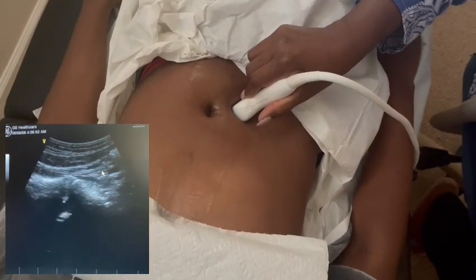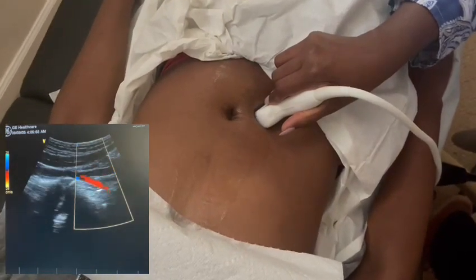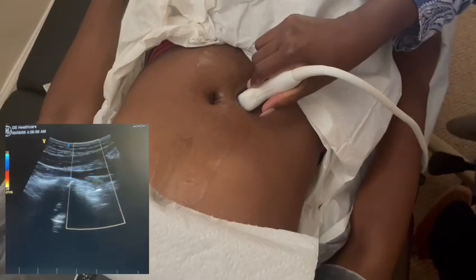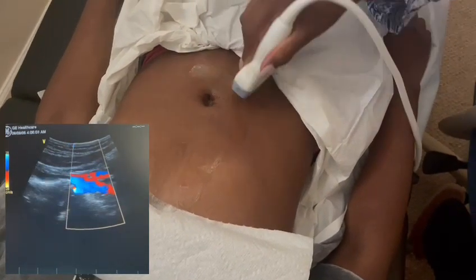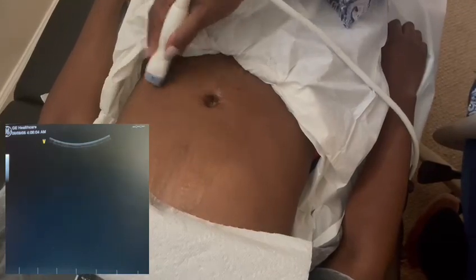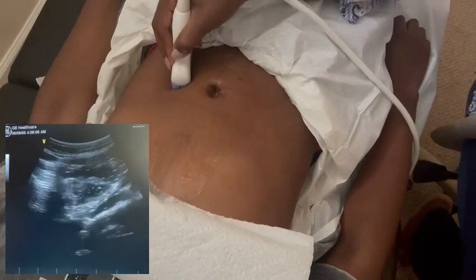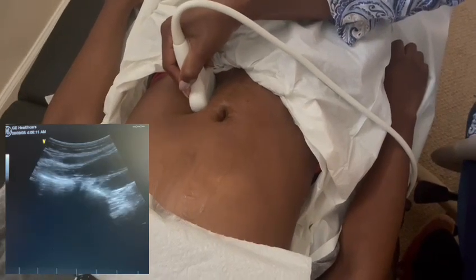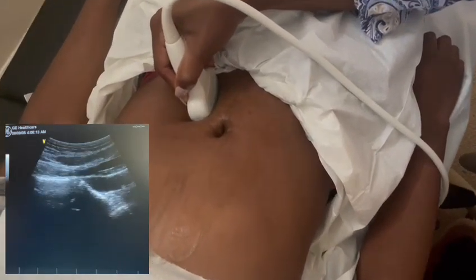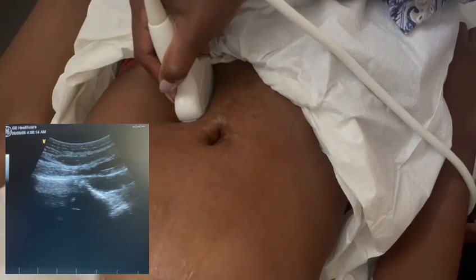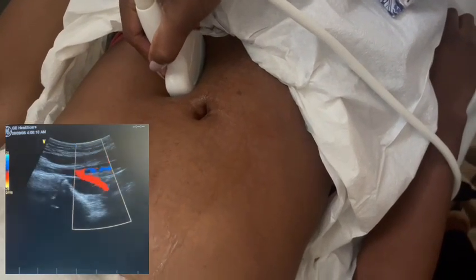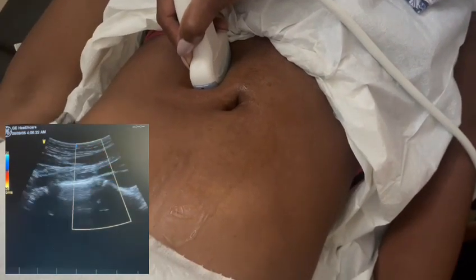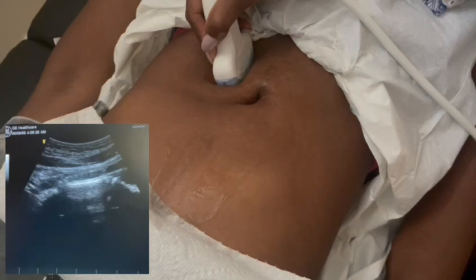If I put color on it, you can really appreciate it — you can see the right common iliac splitting into the internal and external. That same approach also applies for the left side: angle all the way out and slowly come right into the midline, and you should see it pop right at you. With color on, you can see the internal and external right there. Taking color off, you can see that common iliac artery.